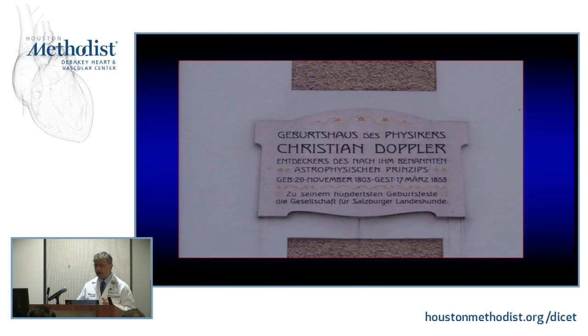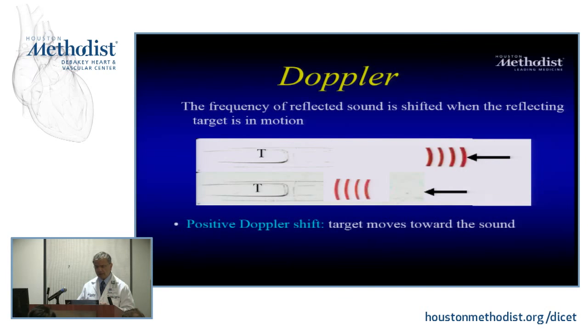So what does the Doppler thing say? Well, the Doppler equation says if there is an emission of sound of a certain frequency, it doesn't have to be sound, it could be light, it could be anything else, and there is a motion of one object in relation to the other, this frequency will change. It may change positively, may change negatively, may not change at all, depending on the position. So that's the Doppler principle in general, right? The frequency will be shifted.